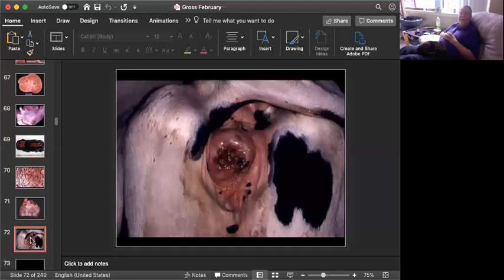Okay, we're looking at generally the white part of this animal. There's a large ulcerated mass on the side of the vulva here. Because it's in a white, sparsely haired area, this, until proven otherwise, is going to be squamous cell carcinoma. Remember, the cattle get a lot of squamous cell carcinoma if they have white skin. They tend to be UV induced, often around the eyes.